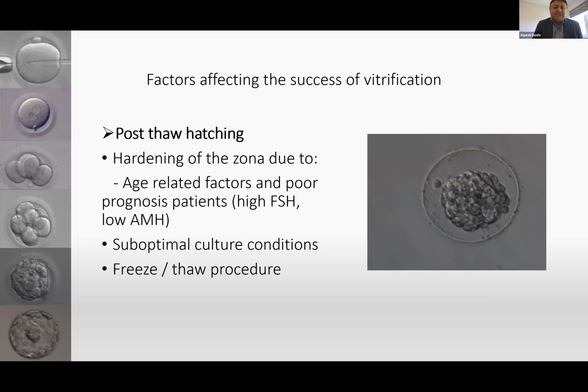Another pointer I wanted to give today was post-thaw hatching. After we vitrify and warm embryos, we also apply assisted hatching after warming. I appreciate that assisted hatching is a very controversial procedure. Our regulators, the HFEA, have placed assisted hatching as a no evidence or limited evidence process, and hence class it as an add-on.